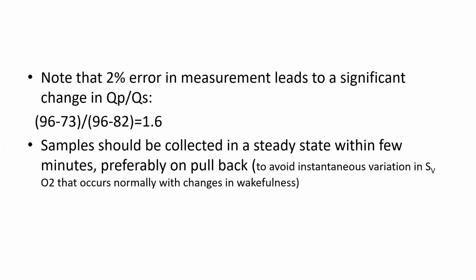Or when I'm doing just the screening PA and SVC, I do those simultaneously from the side arm of the sheath and from the tip of the PA catheter, okay? Because if the patient is asleep and wakes up, his O2 consumption will go up and those numbers will change. Your mixed venous O2 will change. O2 consumption actually will go up, which means the mixed venous O2 will go down.